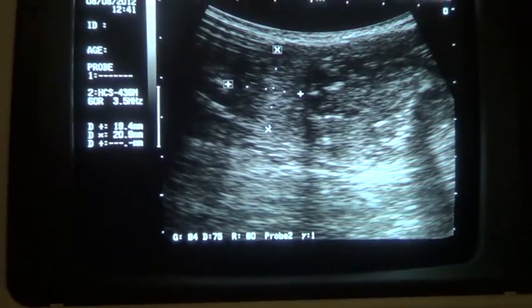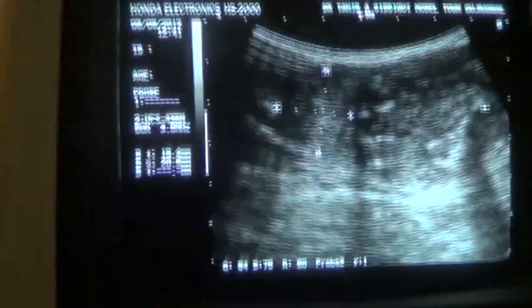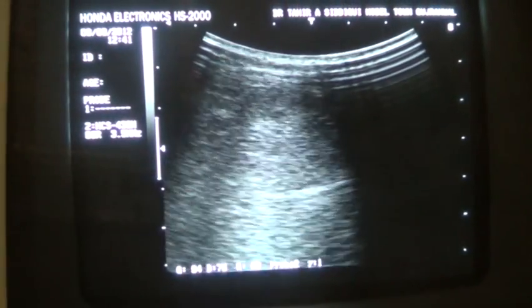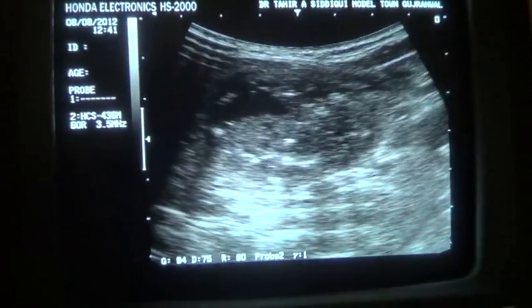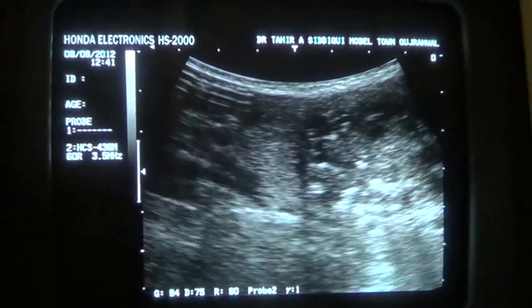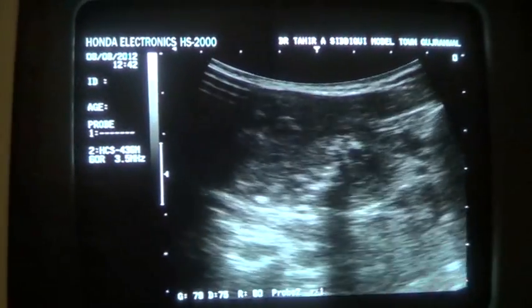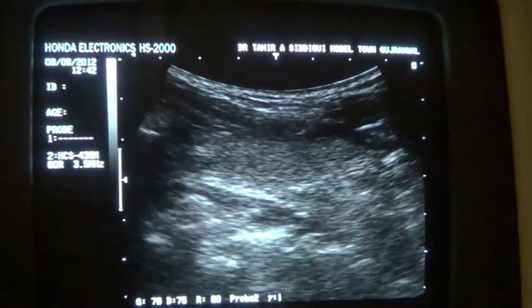It starts from the medial edge of the right thyroid lobe and extends up to the 2/3 of the right thyroid lobe. So this is a thyroid mass with calcifications, internal, peripheral, multiple, uncountable, preserving the lateral 1/3 of the right thyroid gland. The left thyroid gland is normal.